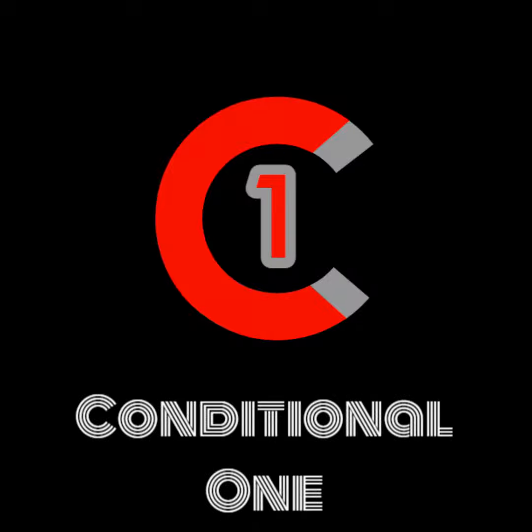So, why is torque an issue? We get why translation is a problem when it turns anything from a hairpin to a hospital bed into a projectile. But torque? Why is something turning to align with the magnetic field a bad thing?